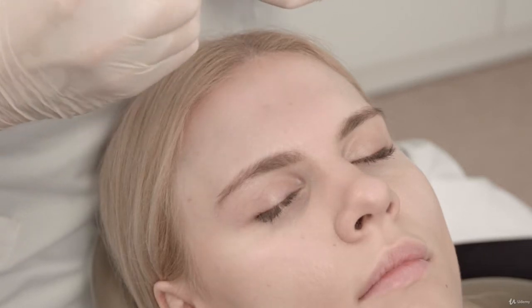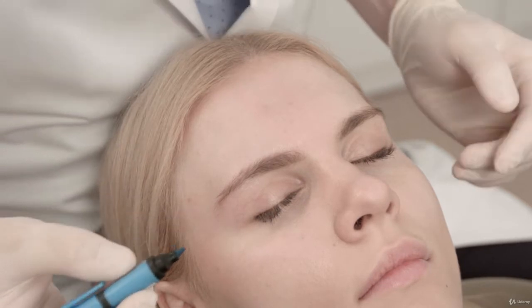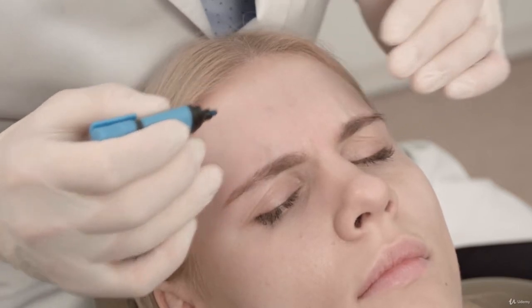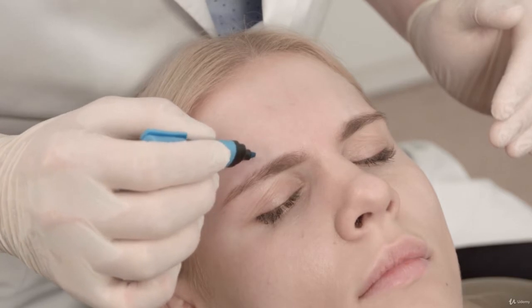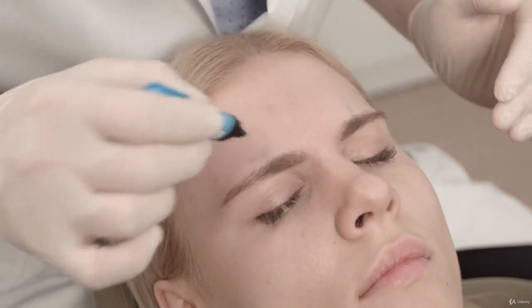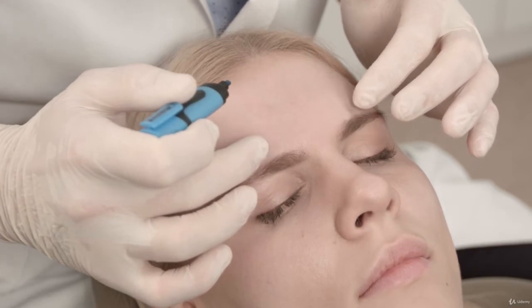Now, to notice where the muscles are, we ask the patient to frown. Okay, thank you. Please remain with the frown position. You see that there's some tension going from here medially, and some tension here, certain ridges form in here. So this is the lateral aspect. We will not inject laterally from here.